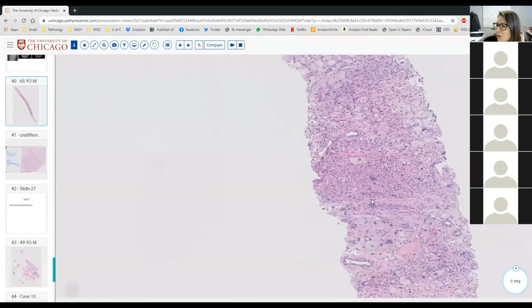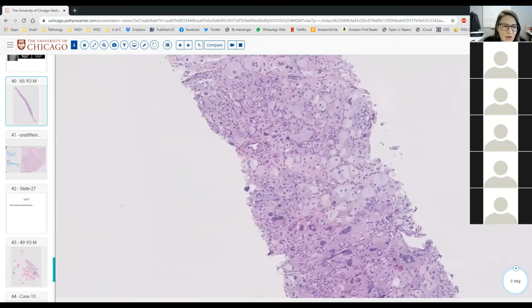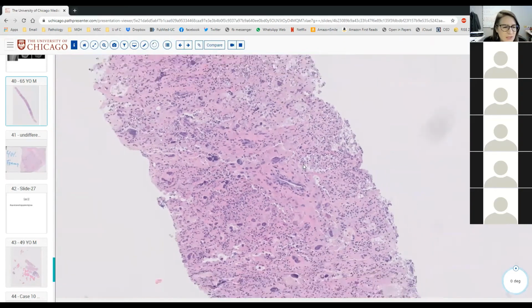I don't think this was a bone met. I think this was just a periosseous tumor compressing the bone and causing it to crack. This is a primary soft tissue tumor that caused osseous fracture. Yep, mass effect. What else do we see? Some background neutrophils with karyorrhectic debris and maybe degenerative looking change.